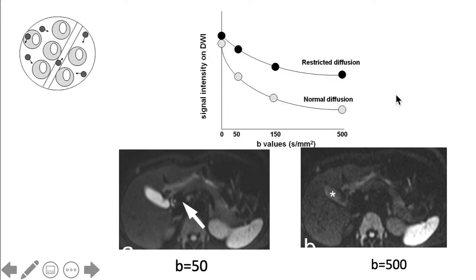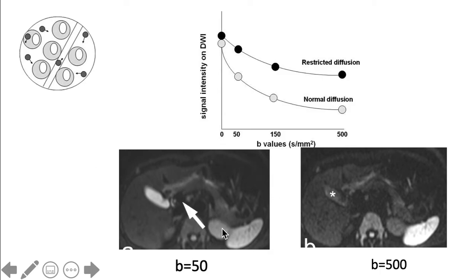This is another image with a B value of 50. Low B values are said to be sensitive to fast motion of water molecules. The portal vein is dark, and this is what we call the black blood image.